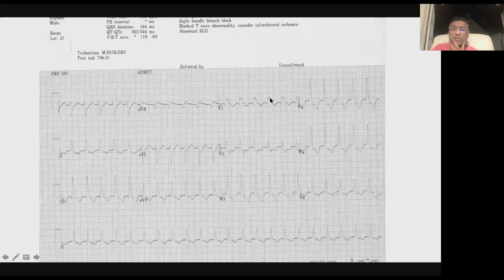So always look at the accompanying leads, because in a 12-lead ECG, the leads are concurrent. This beat is the same beat in all of these leads. In lead V1, this beat corresponds to this beat in V3. The exact same heartbeat is being recorded in all these different leads at the same time. Does that make sense? Yes, sir.